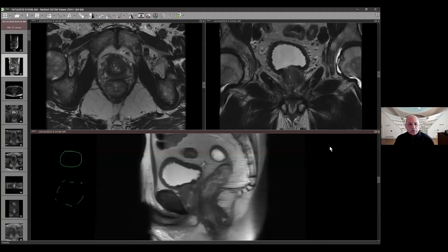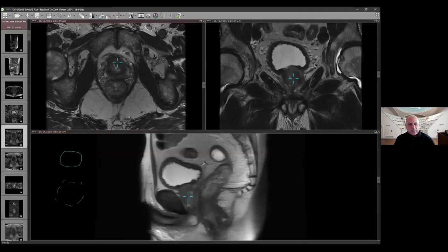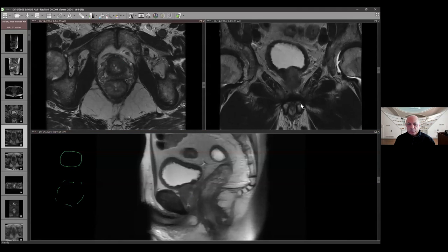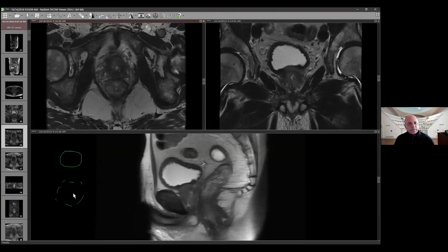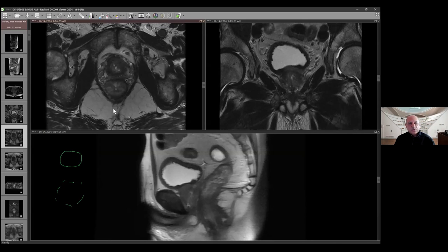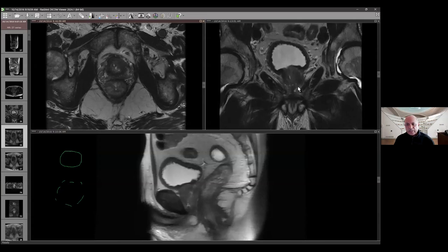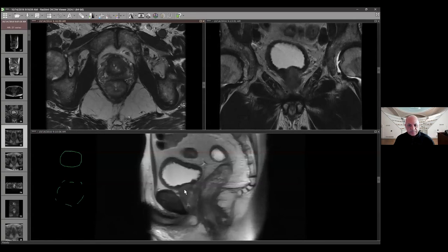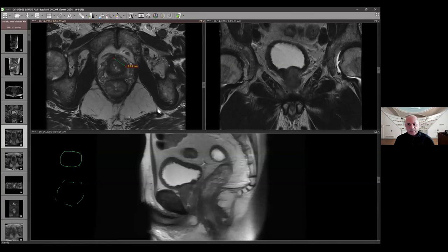If there is no capsule, look inside the lesion. If the inside shows heterogeneity, look at diffusion. If it is relatively homogeneous — as in this case — then look at the size. Looking at all three planes, cross-correlating this area, no matter which plane I look at I am not seeing either a complete or interrupted capsule, which means we are already at PIRADS 3 or higher. The interior is relatively homogeneous in all planes. If it's relatively homogeneous, it's either PIRADS 4 or 5 based on size, and the size here is approximately 2 centimeters — more than 1.5 cm — so this is a PIRADS 5 lesion in the transition zone.